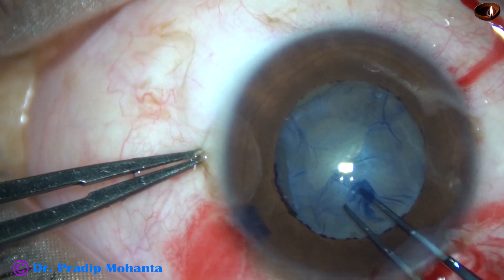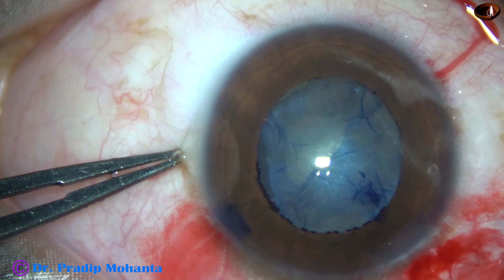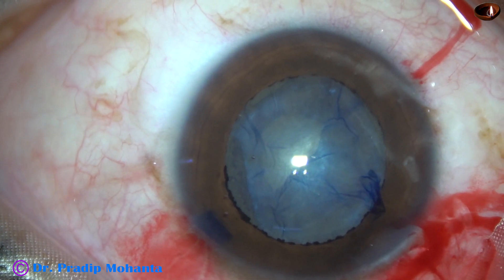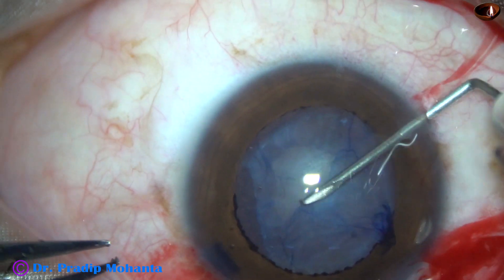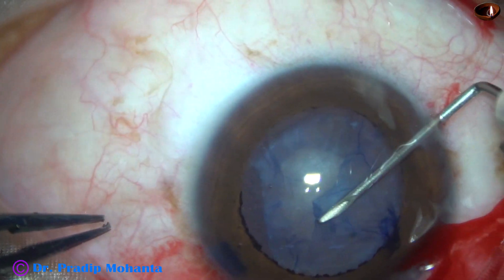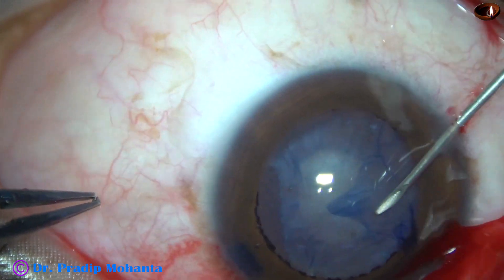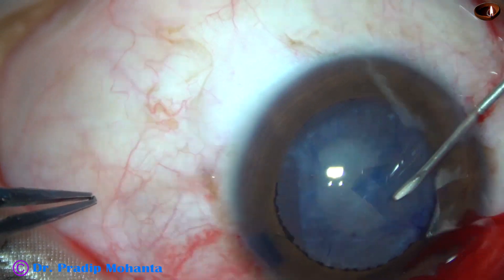So I am trying the same — trying to do a rexis of about 5 mm or around 5 mm. I am using a needle and the capsulorhexis forceps to do a rexis over the fibrous sheet.